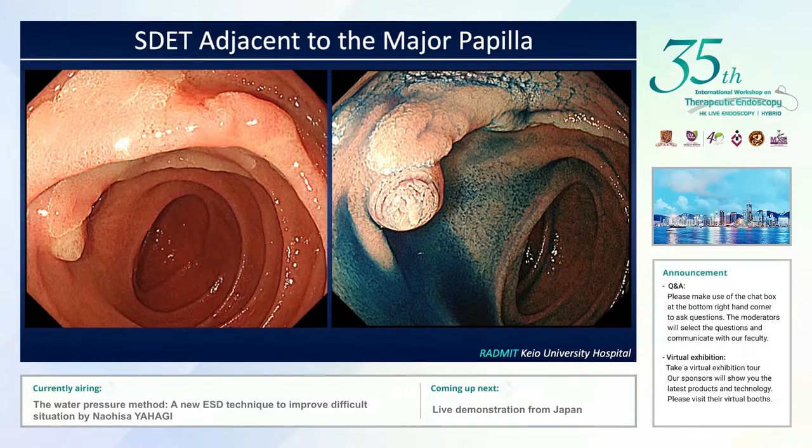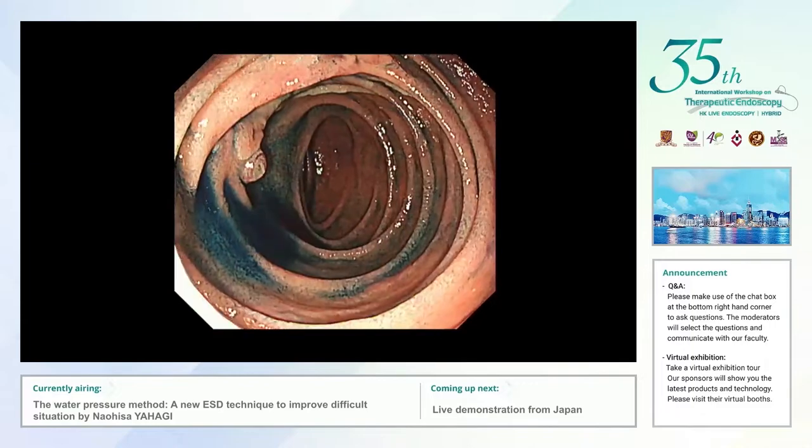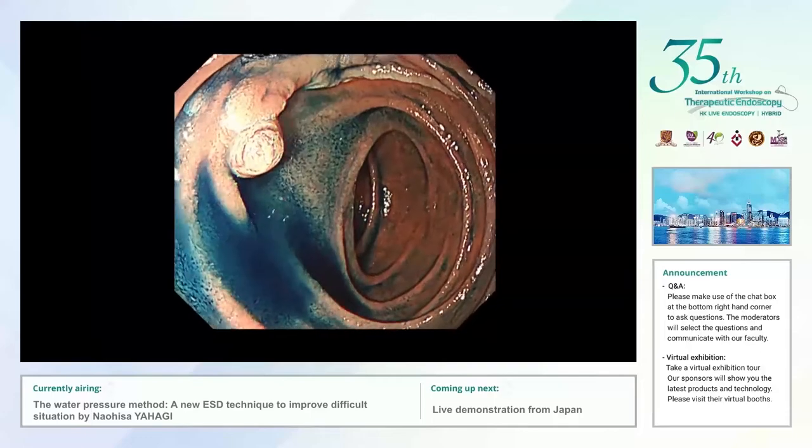I would like to show some cases treated by the water pressure method. This is a flat duodenal lesion located just beside the major papilla. It is quite difficult to remove the entire lesion by standard EMR technique, but surgical treatment is too aggressive for this kind of flat lesion. Therefore, we decided to perform ESD. This is a really challenging case because the lesion is located at the ventral side and extends very close to the major papilla.